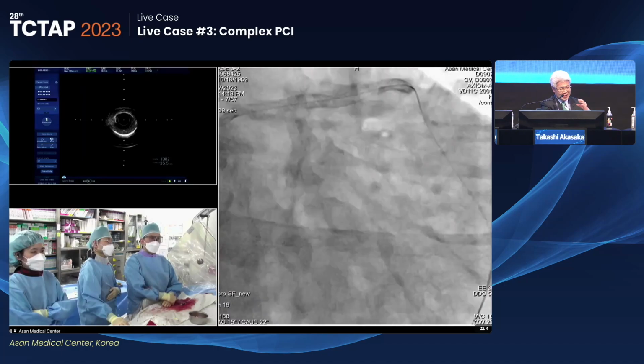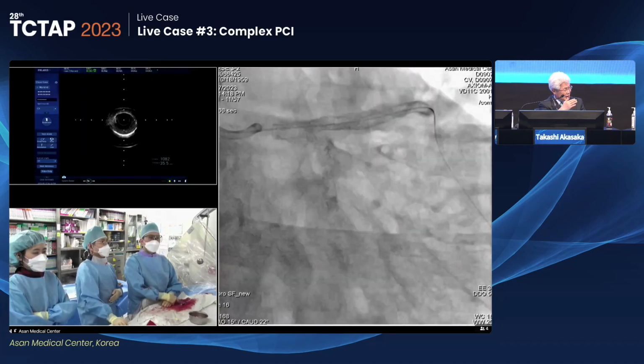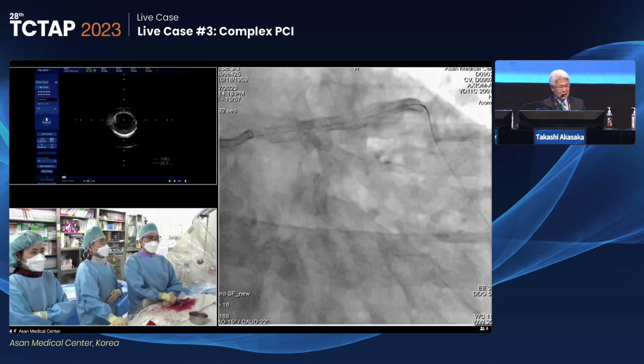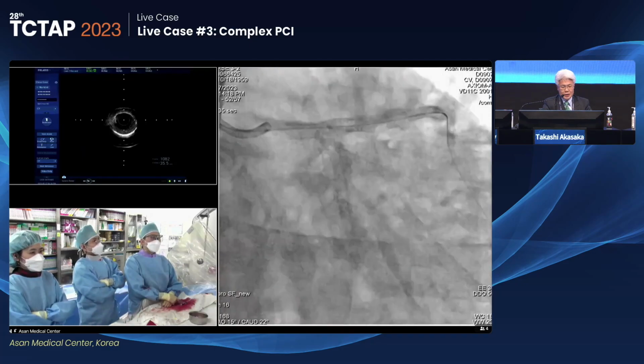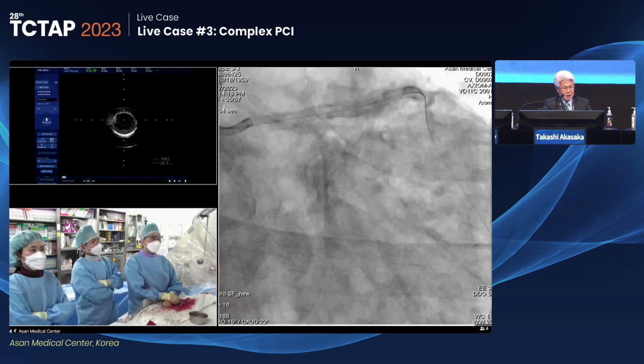And then if you dilate the left main to LCX, it just comes back. So it might be very difficult. But in this case, we are very lucky, and unlucky for the patient, right? But it also depends on your skill for PCI. Yes, thank you very much.